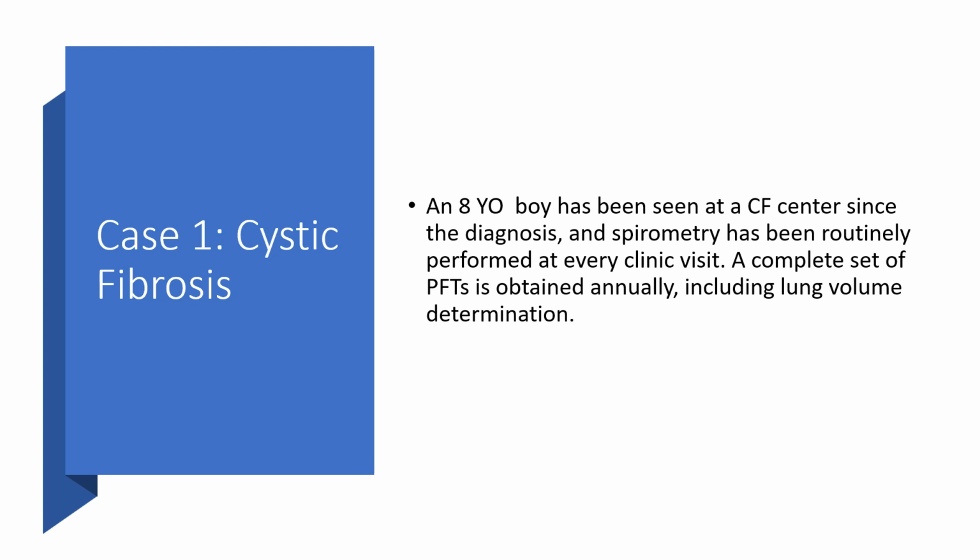Spirometry has been routinely performed. This is again our serial pulmonary function tests, not during an exacerbation because you really want to get the patient's baseline. But certainly if the patient had an exacerbation and that was resolved, then you'd probably get pulmonary function testing a few weeks after the patient's been stabilized. A complete set of PFTs is obtained, I'd say annually, or at least annually, including lung volume determination.